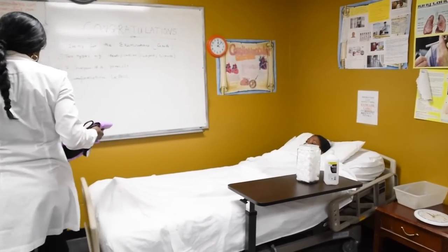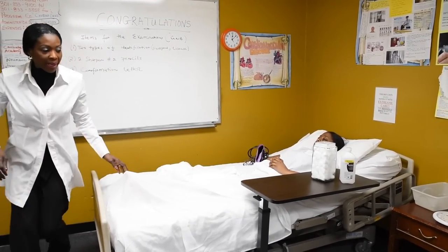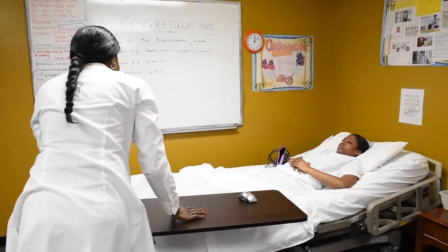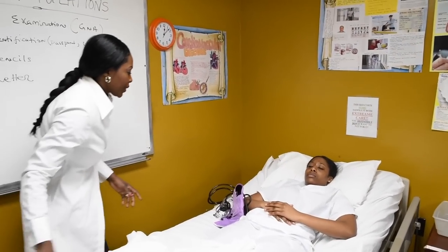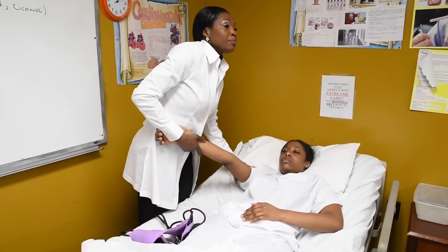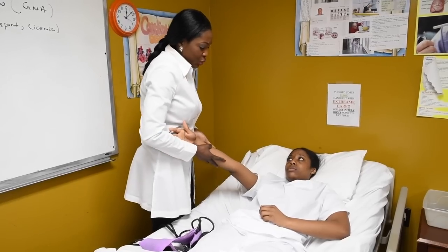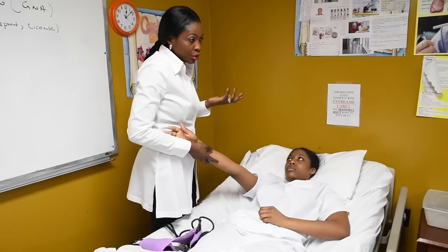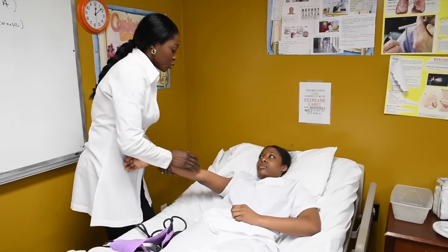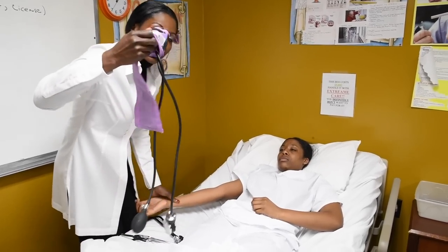Alright. So again, I'm going to stand here so you can see it, so that everybody has a perfect view. We already learned from our lectures that when you're taking blood pressure, the patient's arm should be exposed. In this case, it's very easy, unless your classmate is wearing a sweater underneath their uniform the day of the exam. But if they are wearing a sweater, then you would move it out of the way to expose the upper arm, thus exposing the brachial artery, okay? So that's what you're doing.